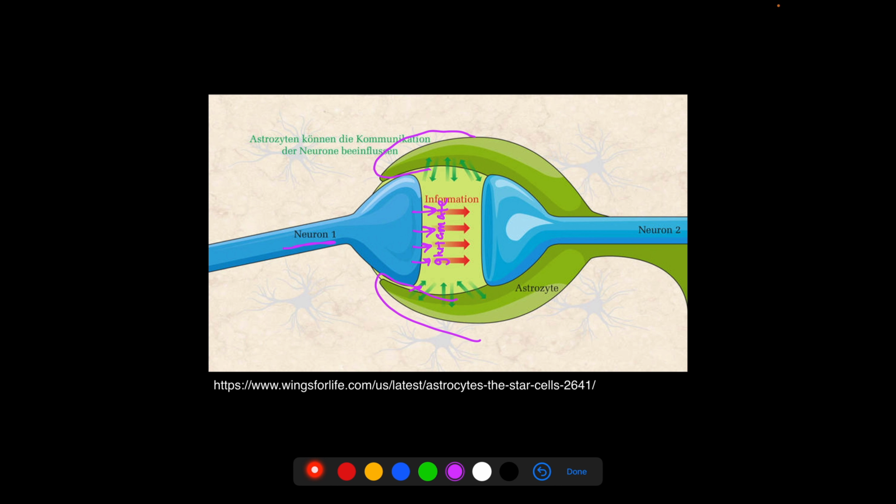And this specific action, so these green arrows here, requires energy. And this pulls oxygen out of the surrounding blood supply. And this consumption of oxygen is what causes the initial magnetic shift that the BOLD signal measures, completing the circuit from thought to signal.